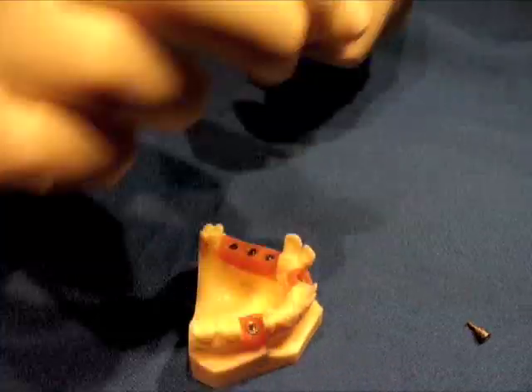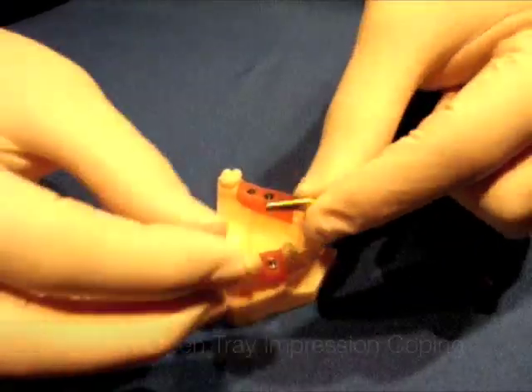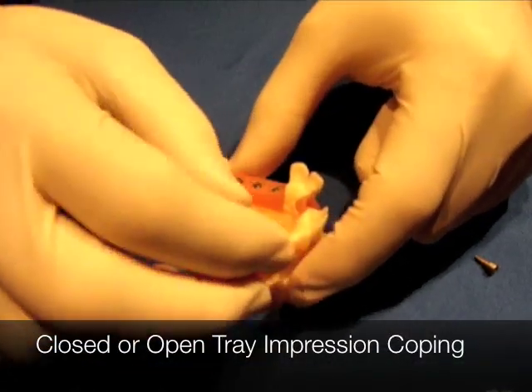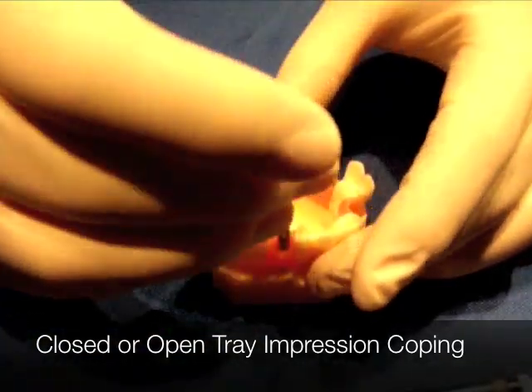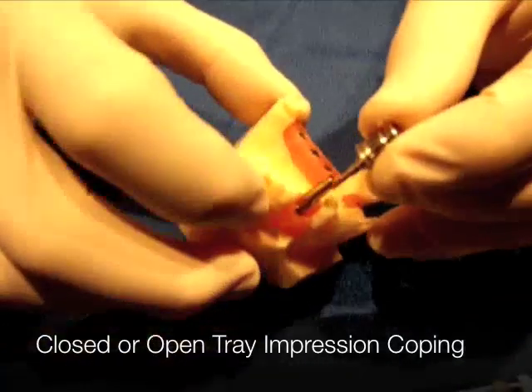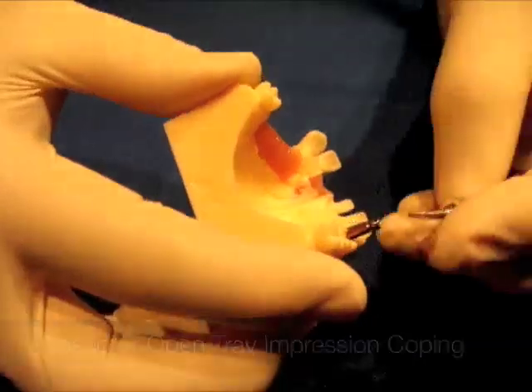Then what you're going to do is put on — this is a closed tray impression coping. You may use an open tray impression coping, but you're going to spin this on first. As you do, you take your UniGrip driver, place it in, and tighten it down.